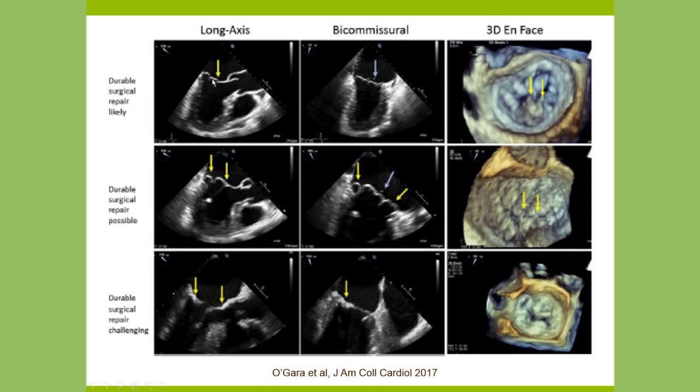And you see here thin leaflets with, I don't know how well this shows up on your screens, but the posterior middle scallop is flail here. You can kind of see a little torn cord here and here. So this is flail P2. You see that beautifully on this 3D view here. This is highly repairable, the 98% success rate. In our hands of our surgeons, the mortality rate for this is 0.